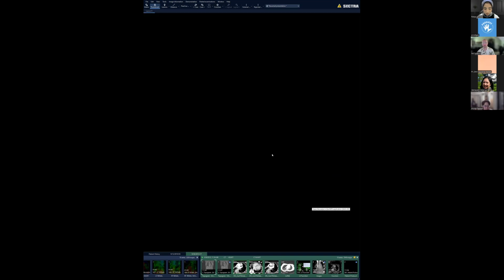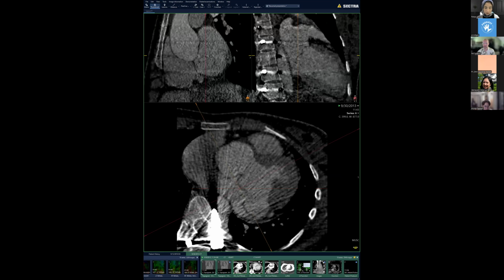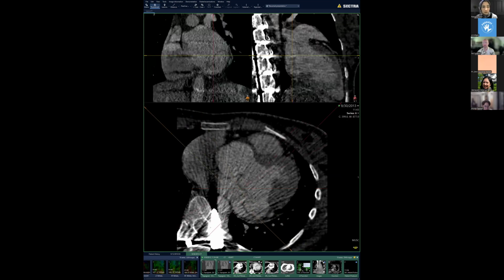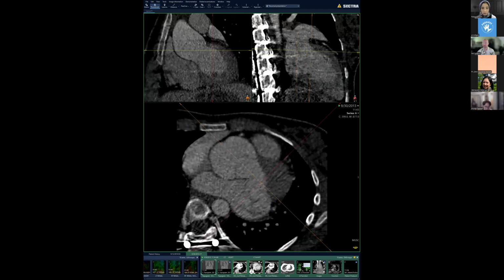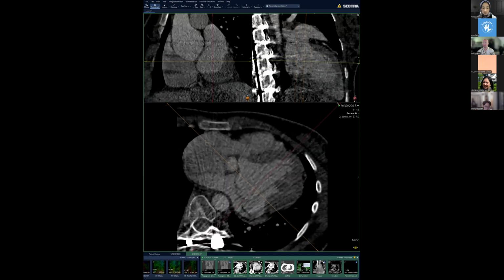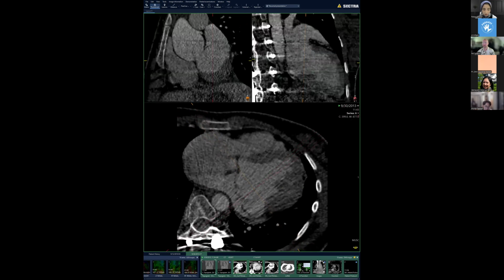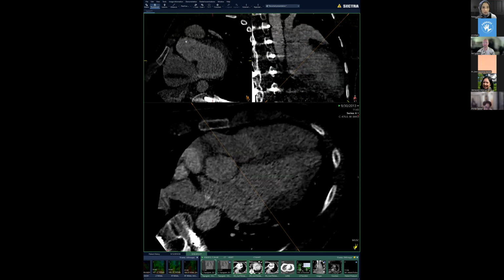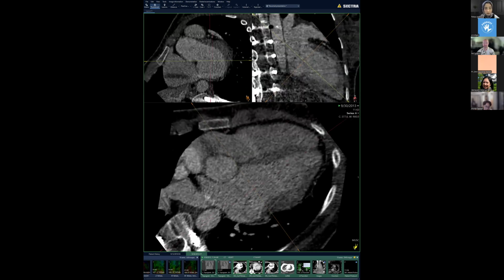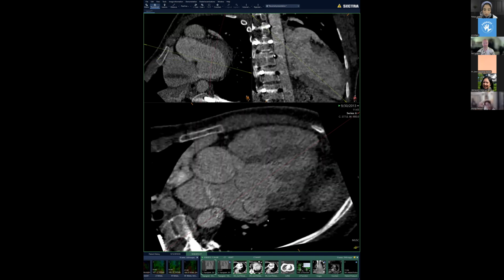And then, of course, you would go into a multiplanar reformat, like so. You put your center of rotation somewhere in the center of the mitral valve. Then you see on your two-chamber view, you confirm that that is also in this dimension central in the mitral valve orifice. Then you angle it so you're lining up with the apex of the left ventricle as much as possible in both of these views. And then you can spin your axis around, with the central axis being in the mitral orifice. And as you spin it around, you can fully examine the mitral valve, all its portions.